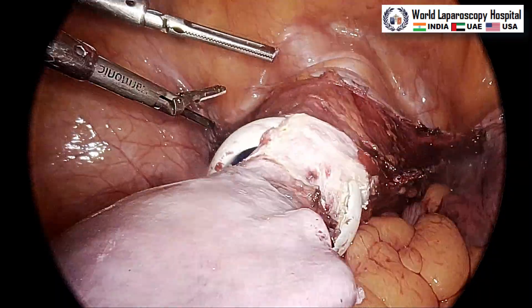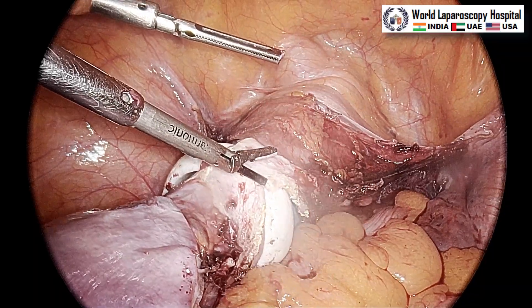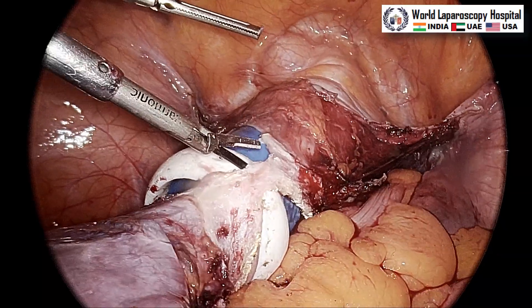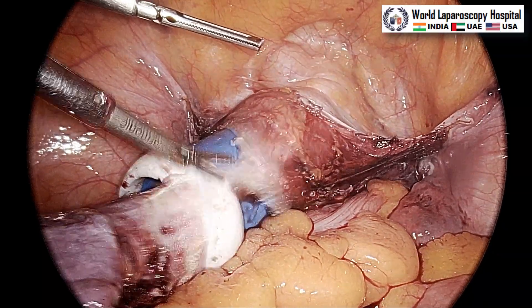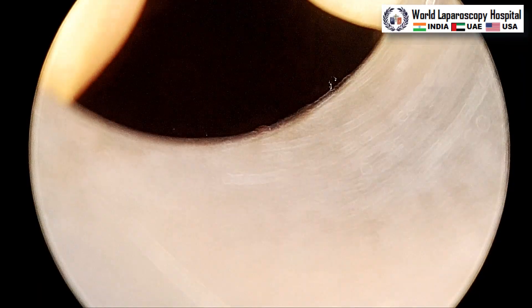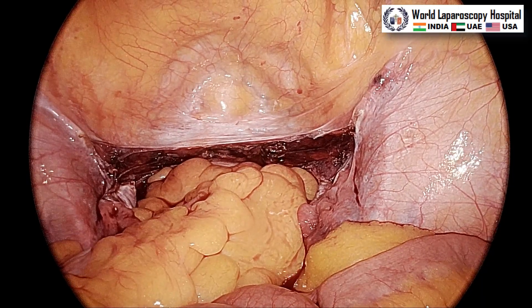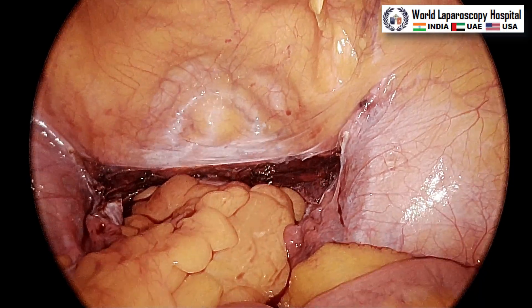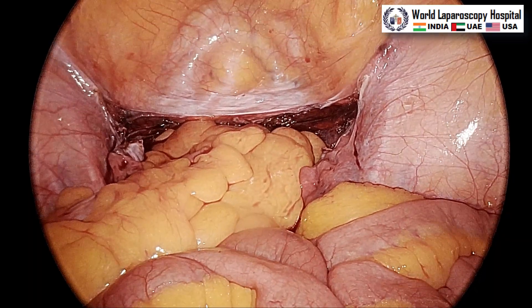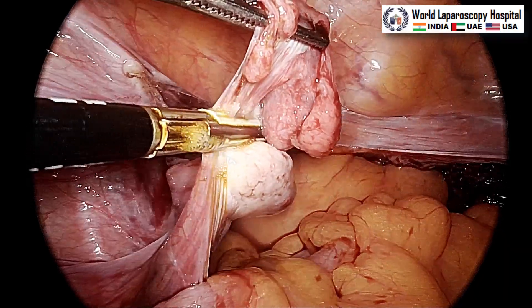The surgery is almost over — just a little bit of the anterior vagina is still attached. Take care that overshooting of the instrument should not happen and overstretching should not be done by the assistant. After that, the uterus will be removed. Then we will remove both fallopian tubes — hold the tube in the middle and give anteromedial traction. This has the advantage that you will only take the ovarian ligament and mesosalpinx without devascularizing the ovary, leaving the ovary in place.